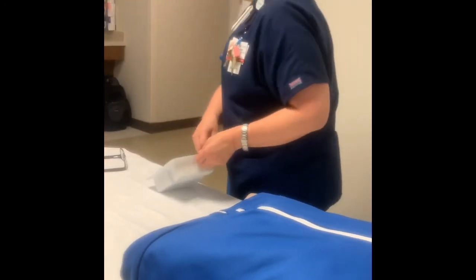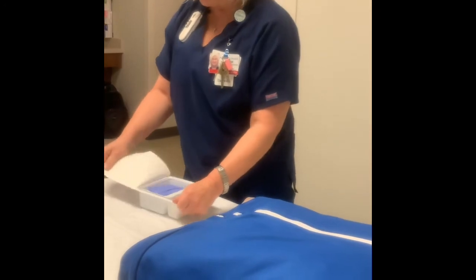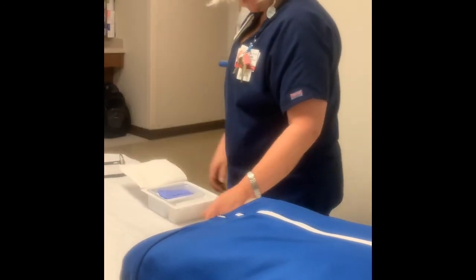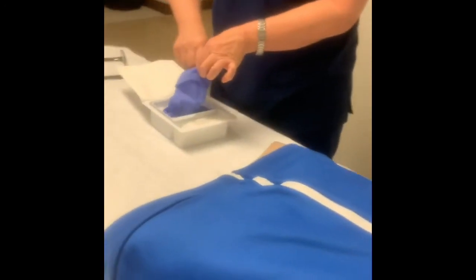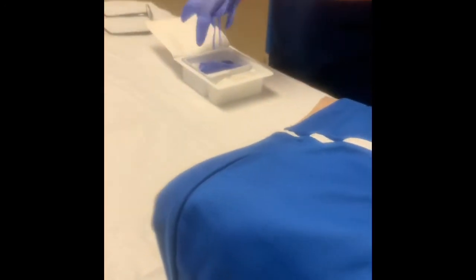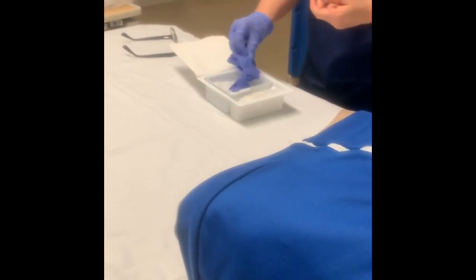Do we ever use peroxide anymore? No, peroxide is not used. We want to use regular saline. Absolutely. So, same thing, you're going to have a couple of gloves here. Okay, you want your saline out. And I always have someone put saline in for me.